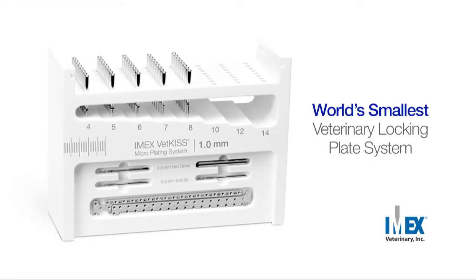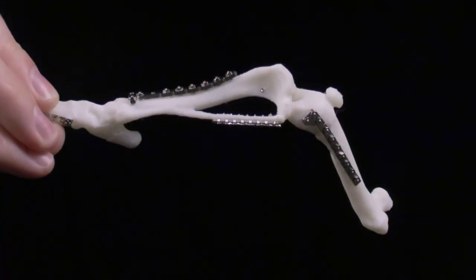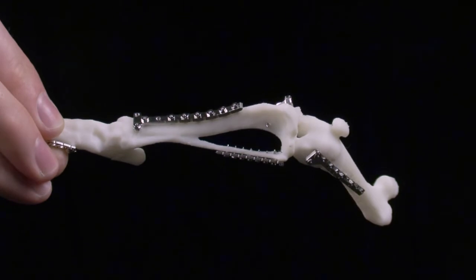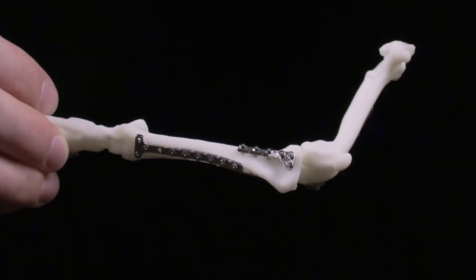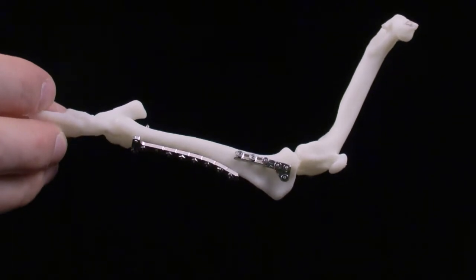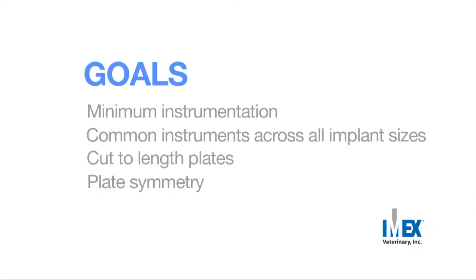The VetKISS microplating system by Imex is the world's smallest clinically tested veterinary locking plate system. The KISS, or Keep It Simple Surgeon approach, defined the development of this user-friendly and cost-effective osteosynthesis system. KISS design goals include a minimum of required instrumentation, common instruments across all implant sizes, cut-to-length plates to minimize implant inventory, and plate symmetry eliminating the need for right and left plates.